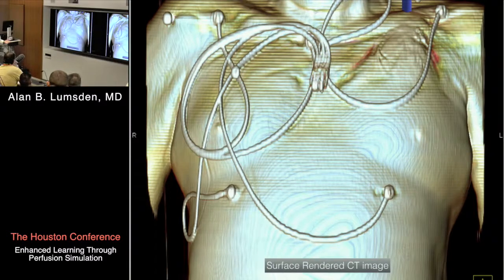If you change the windowing of it, you can see the patient. You can see their clothes. You can see leads that are on them. You can see scars on them. And so think of this now as being your view of the patient lying on this table. You're used to seeing these cross-sectional pictures. It's just the way this is presented. If we had a scan of my face, you'd have me kind of sitting up there, but you never present the data like that.